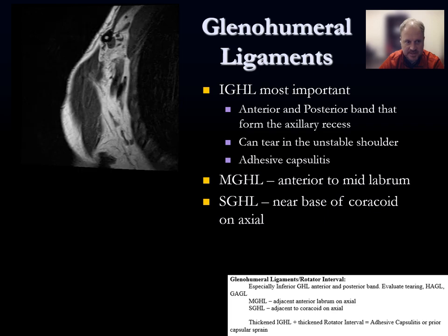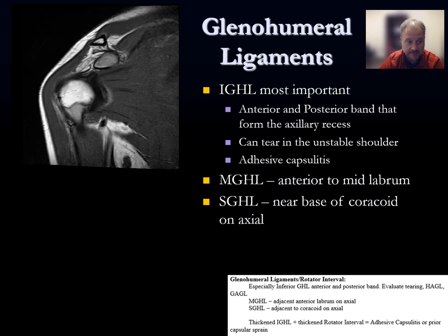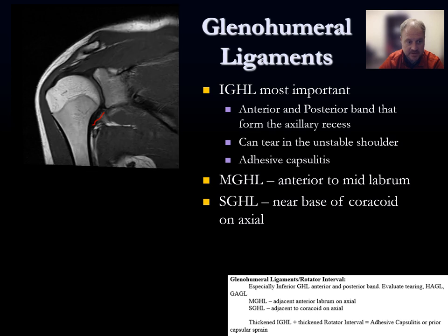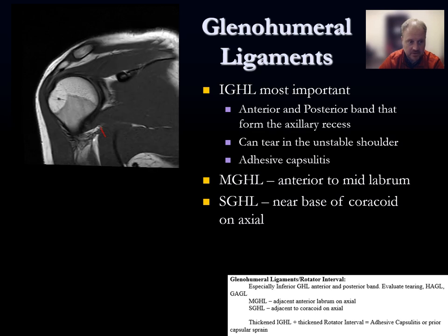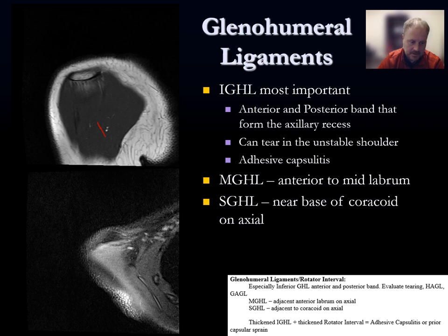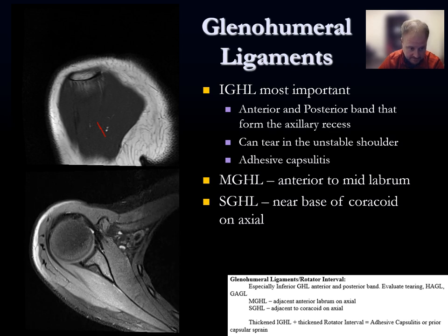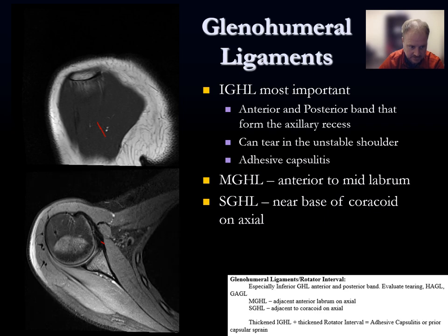On coronal images, scroll through looking for the inferior glenohumeral ligament as a dark black ligament along the inferior glenohumeral joint — anterior band then posterior band. On axial images, with the subscapularis visible anteriorly, find the middle glenohumeral ligament right in front of the anterior labrum. In a normal case it appears as a thin dark structure immediately anterior to the labrum.